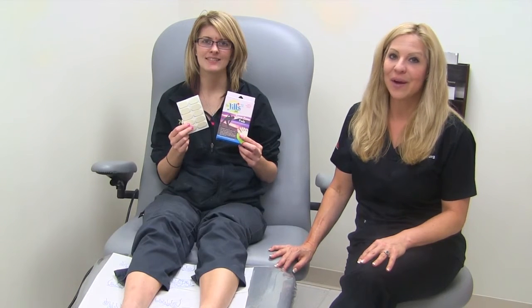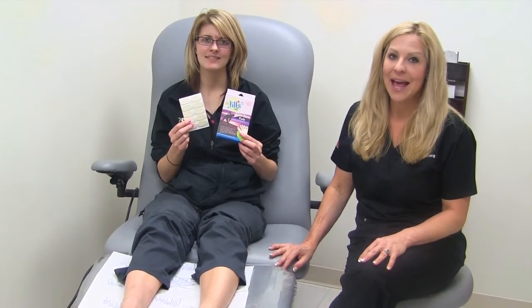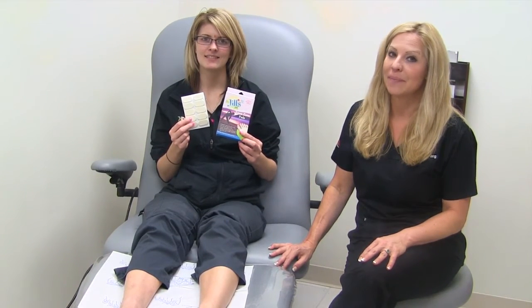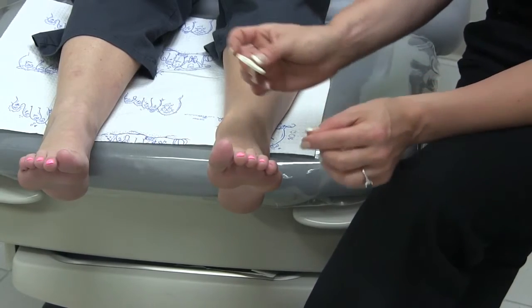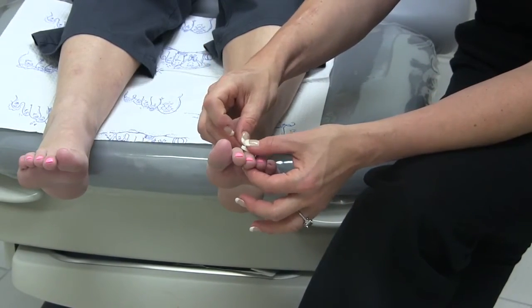Directions: apply to a clean, dry area on the foot. Then carefully separate the foam corn pad from the backing and apply by placing the hole directly over the corn or tender spot. Here we have the foam corn pad — you apply it over the bony prominence of the skin. Let's pretend she has a corn right here on the top of her toe. You just place it on top.